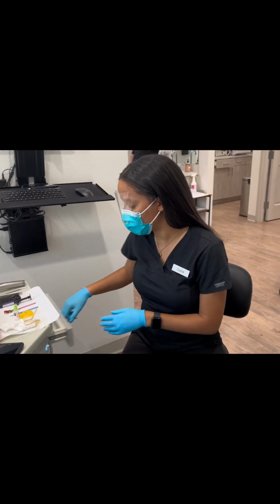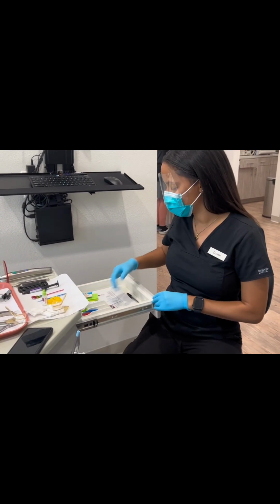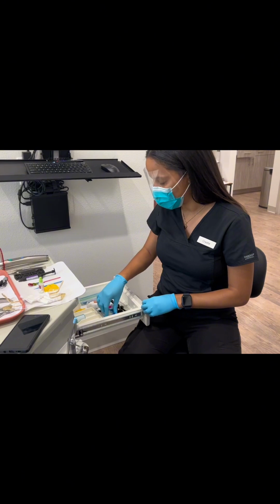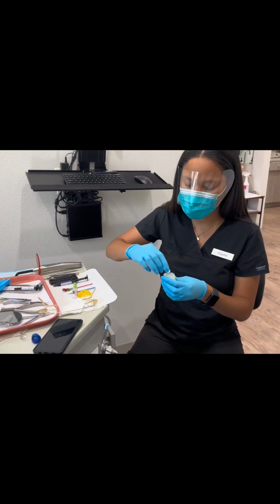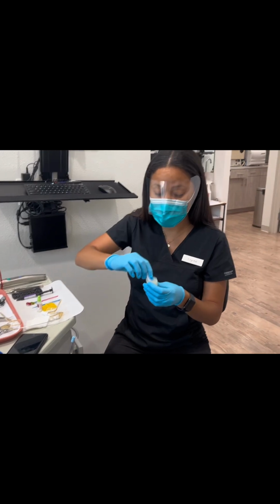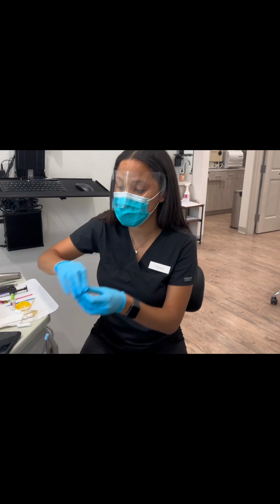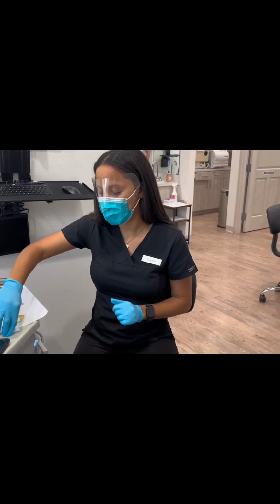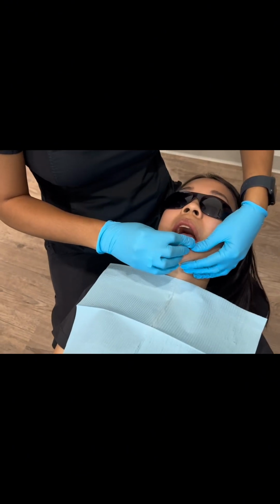We're going to go ahead, and a lot of times I like to start with a little bit of Vaseline. Where's my Vaseline? Here. And so what I do is I take one of these cotton rolls. Once you've dipped it into the Vaseline, you're going to close it. Clean gloves still, put it in the corner. We're not using that anymore, okay? Everything has to be sterile. Everything has to be nice and clean.